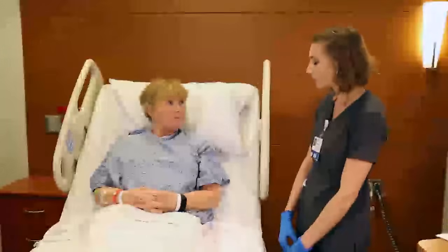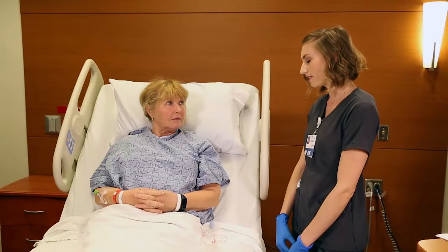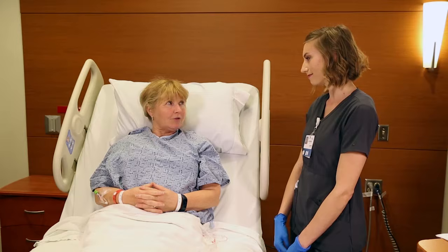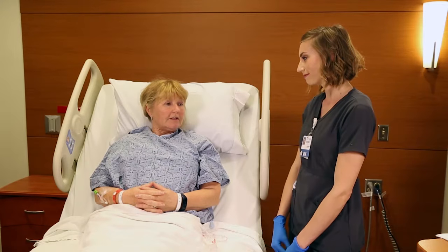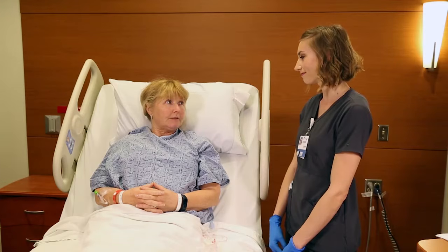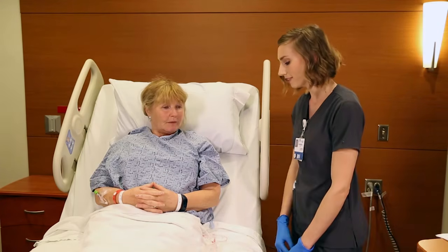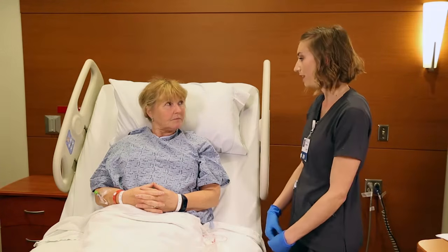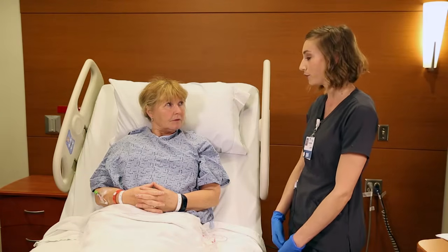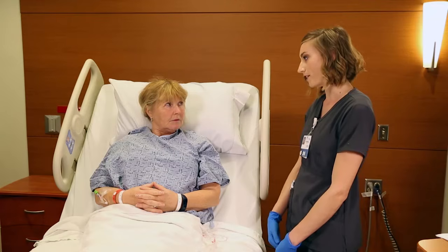Can you tell me when your surgical drain will be removed by your nurse or doctor? It's usually removed when there's 30 cc's, 2 tablespoons or less for 2 straight days in a row. This can happen at first post-op appointment, or it may take up to 3 weeks. Yes, that's correct. When your surgical drain is removed, you can still shower, but you will not be allowed to soak in a tub or swim until it's okay by your doctor.